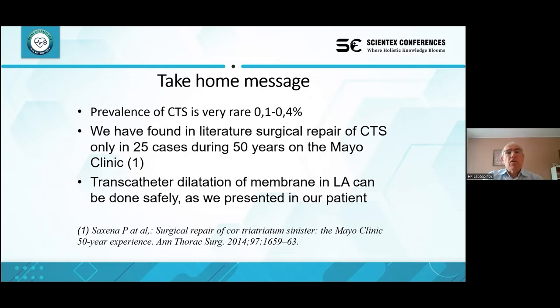We can take a home message. The prevalence of CTS is very rare, 0.1 to 0.4%. We have found in the literature surgical repair of CTS in only 25 cases during 50 years at the Mayo Clinic. Transcatheter dilatation of the membrane in the left atrium can be done safely, as we presented in our patient.